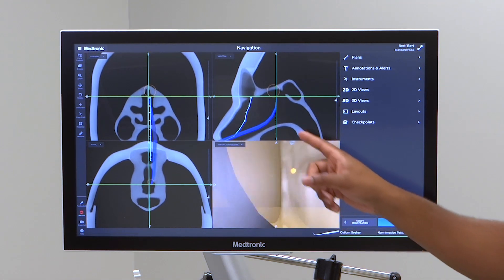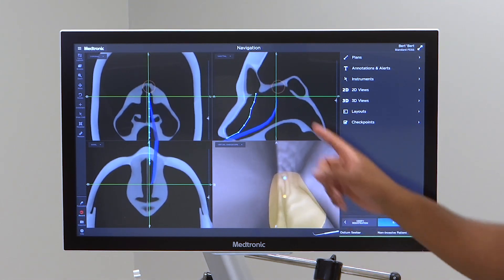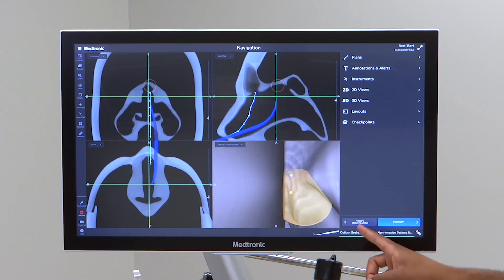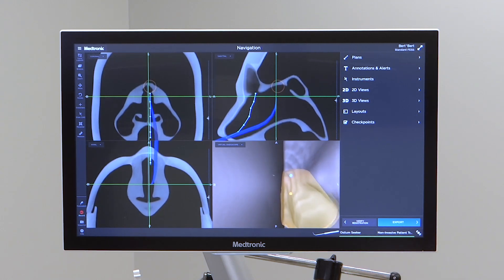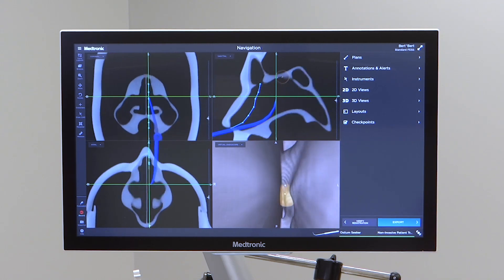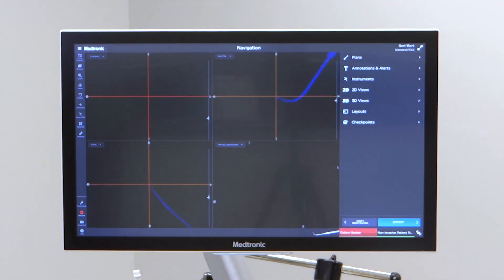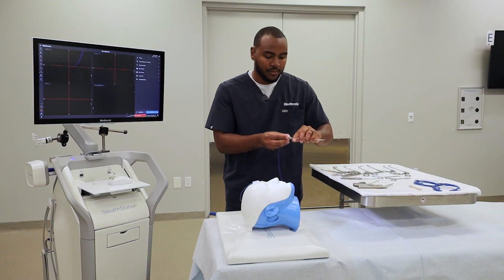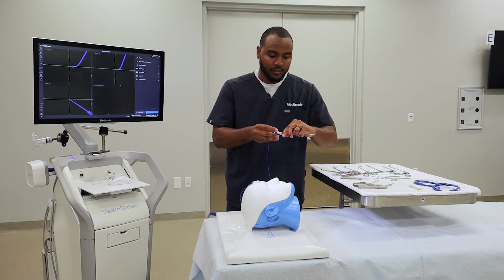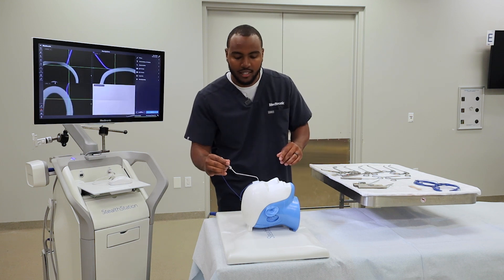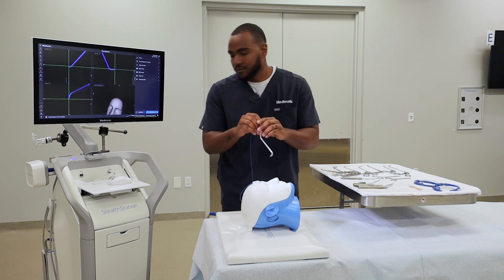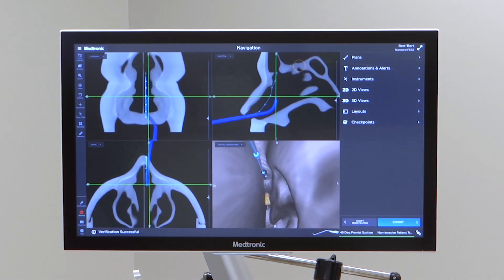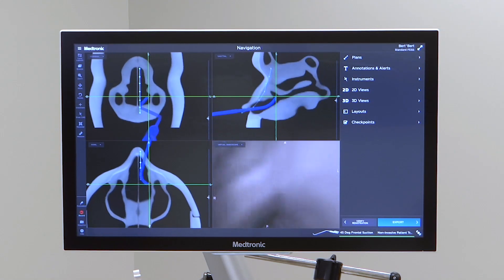One thing I want to point out is the CAD model. So as you're inside the anatomy, I'm now using a frontal ostium seeker, and that is visible there. Any rigid instrument you put on, it will show. I'll verify this 45 degree suction, and you also see that that is now in the field as well.